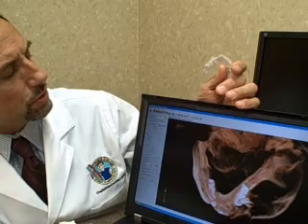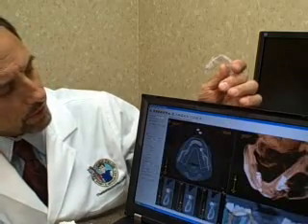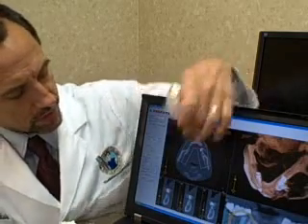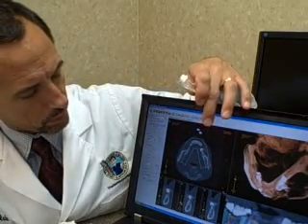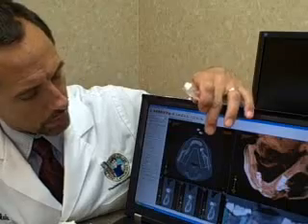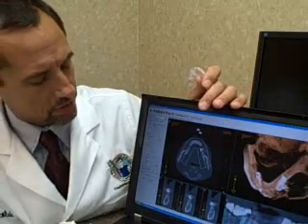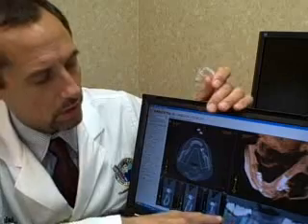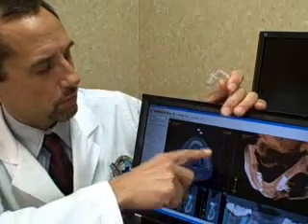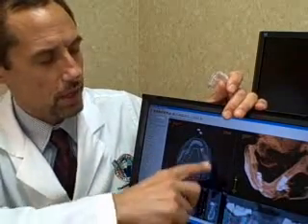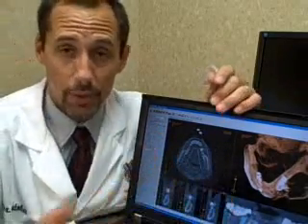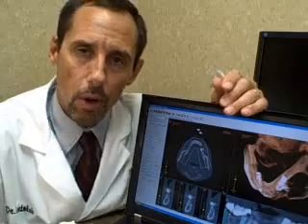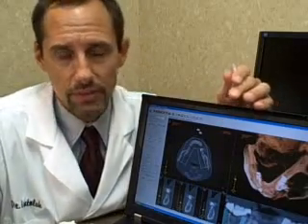If we go to a different menu here, this shows at the bottom exactly where an implant would go, and you can see here where the jaw is. With the three-dimensional views from different angles and sections, we can determine the best placement and also determine the quality of bone — because the more dense the bone is, the more successful the implant will be.